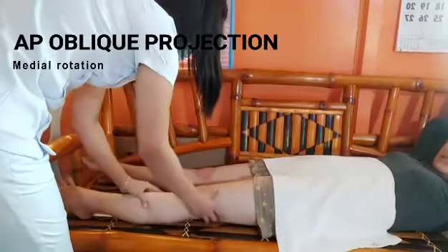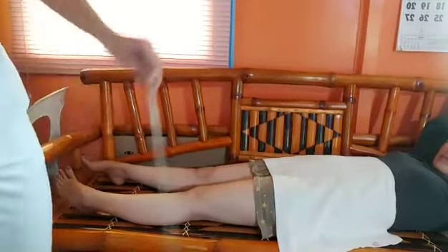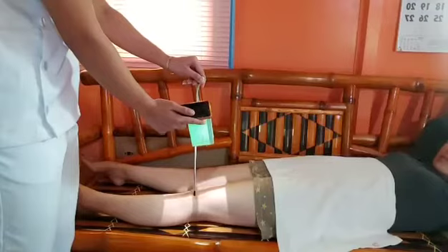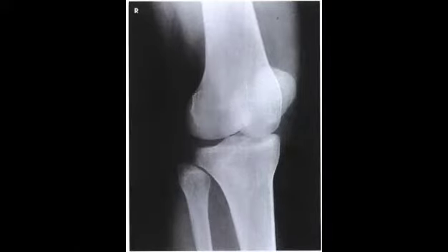Place the patient on the radiographic table in the supine position and support the ankles. The resulting image shows an AP oblique projection of the medially rotated femoral condyles, patella, tibial condyles, proximal tibiofibular joint, and the head of the fibula.